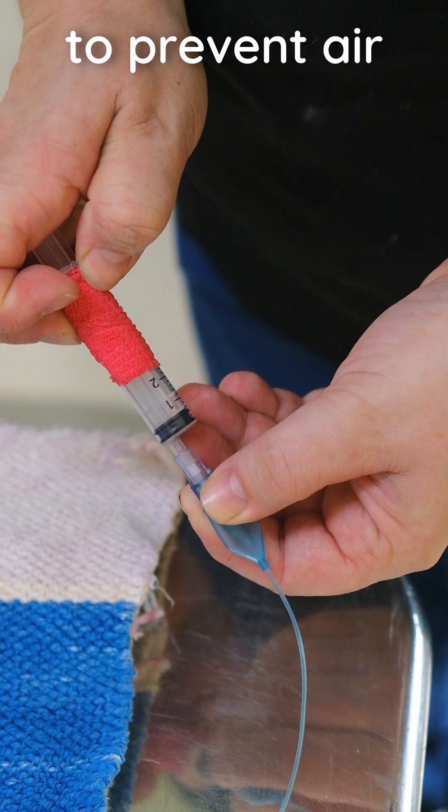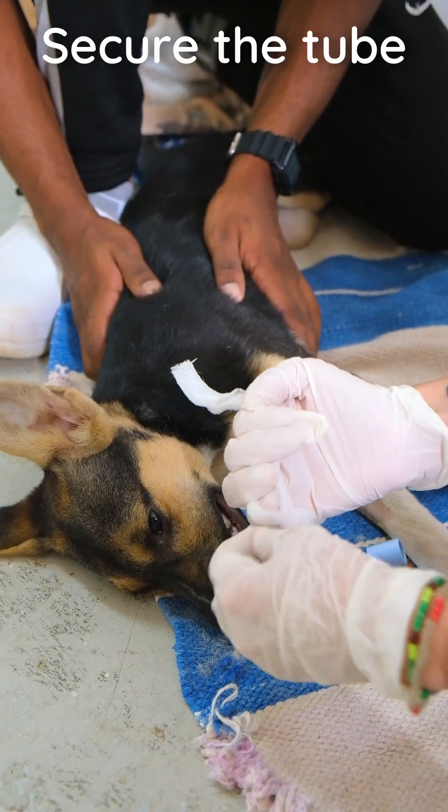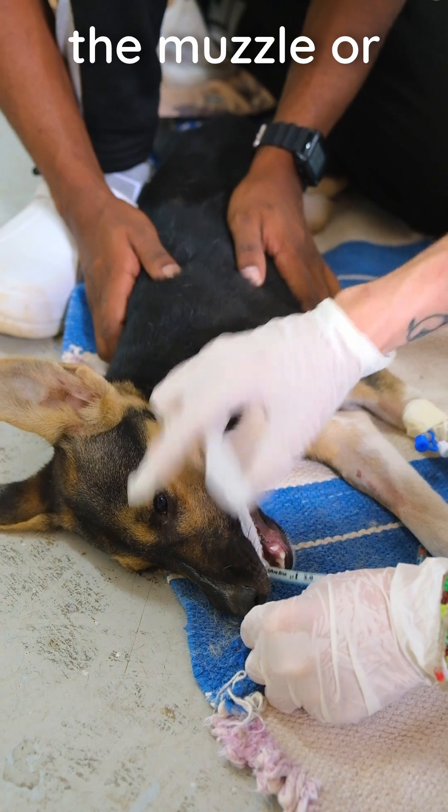Inflate the cuff just enough to prevent air leakage but avoid excess pressure. Secure the tube in place with a tie around the muzzle or behind the ears.